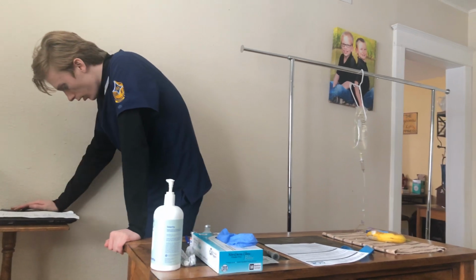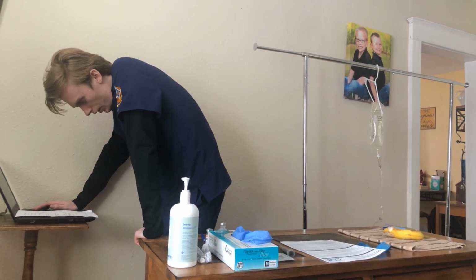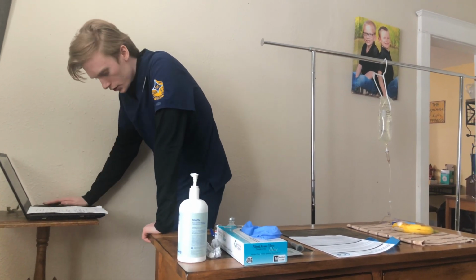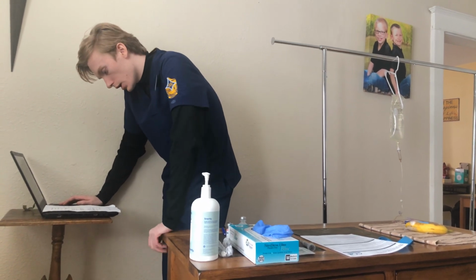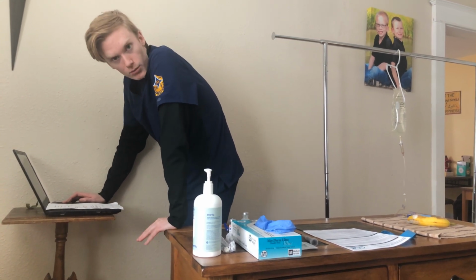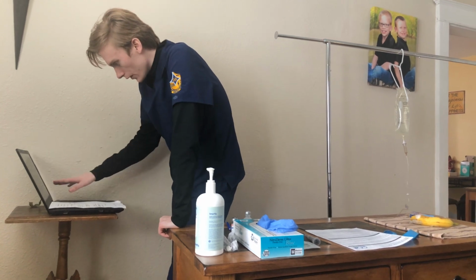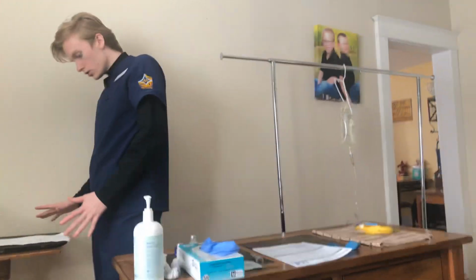Within the label of Dilaudid, it says 2 milligrams per mil and dilute with 2 mils normal saline for IV administration. So after doing the conversions and all the mathematics around that, we are going to be drawing up 1 mil of medication with 2 mils of normal saline to dilute, in which I'll be drawing up a total of 3 mils for the injection. Now that we have again identified the 6 patient rights and we meet everything, we are good to continue.